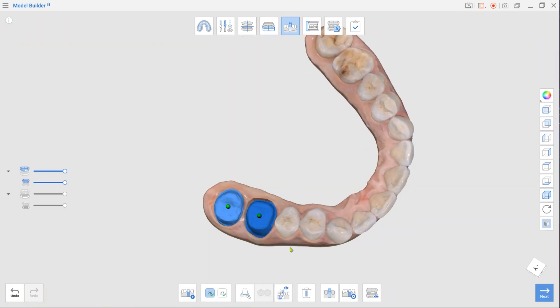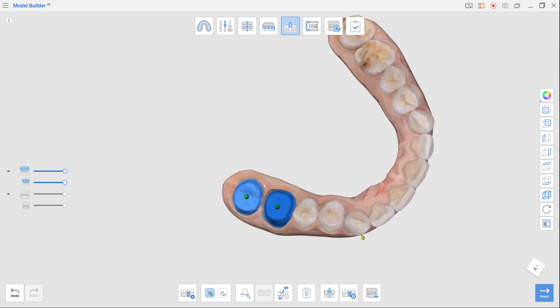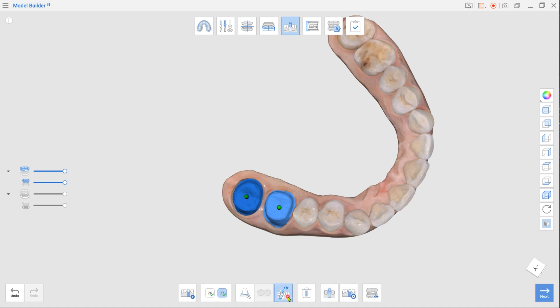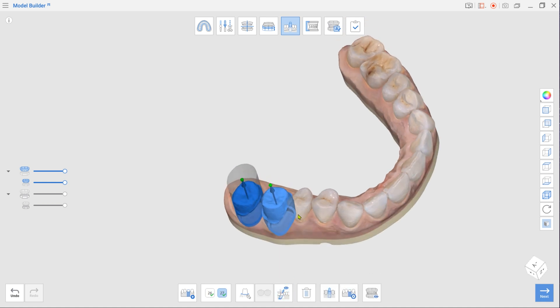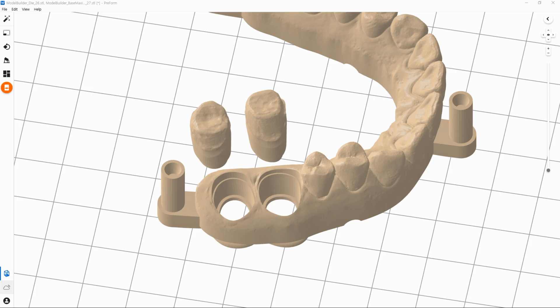Rotate the model so that your view direction would match the die insertion path and click Set Die Insertion Path from Viewpoint. Repeat this process for each die. To create detachable dies, make sure Cut Out Dies is selected in the toolbox.